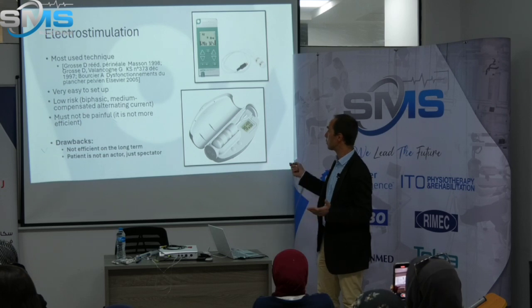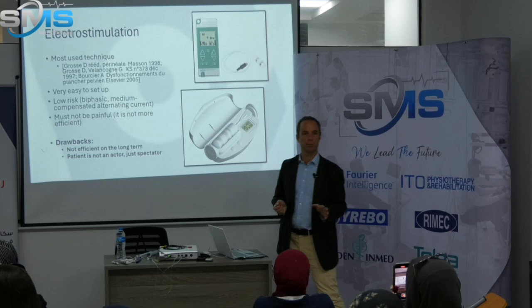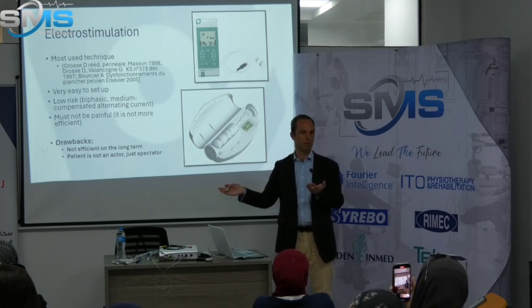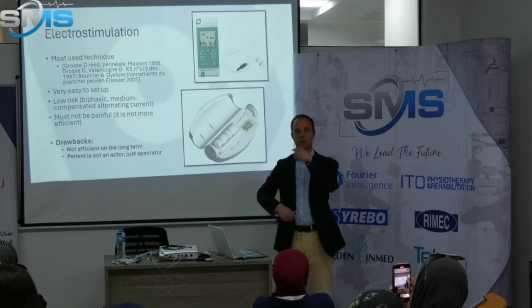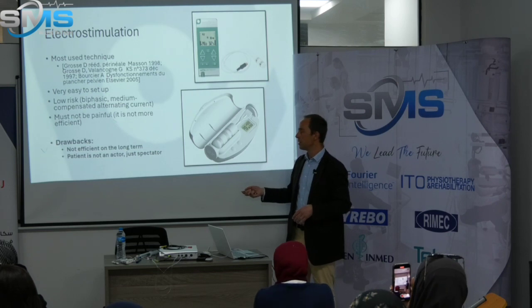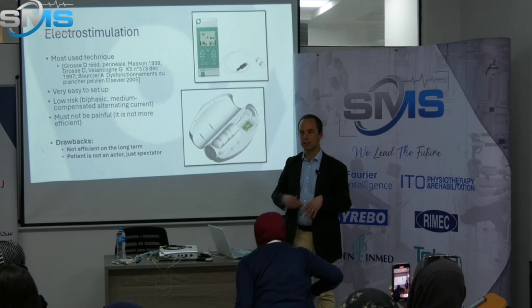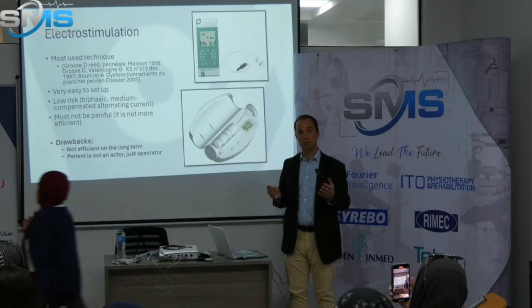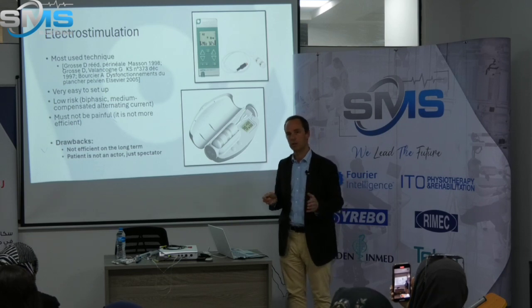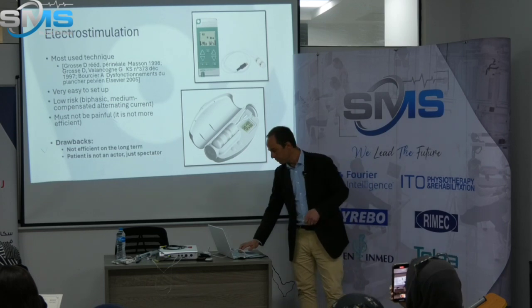Okay, so this technique works very well, but it has very important drawbacks. It's not very efficient in the long term. The strength you gain with electrostimulation, you will lose it within a few months. So it means doing it again and again and again, because, mainly, the patient is not an actor. And sometimes you can have some ladies going through rehabilitation and having good results, but they do not understand at all what their pelvic floor is. And that's not what we want, because that's not how it will be efficient in the long term.